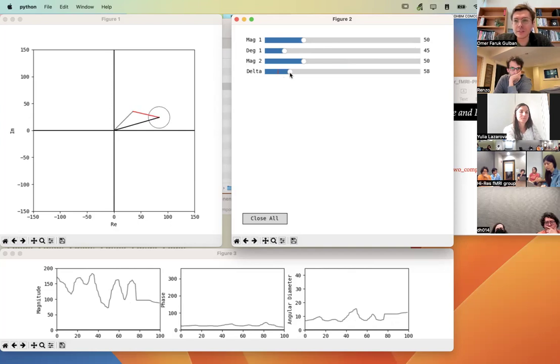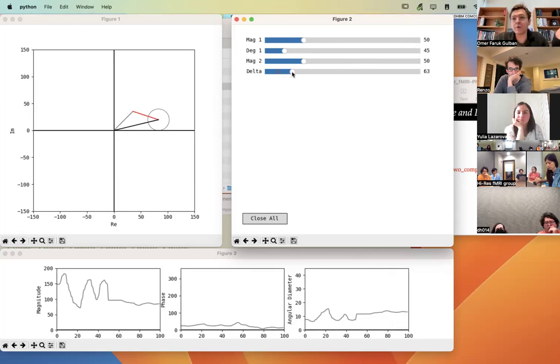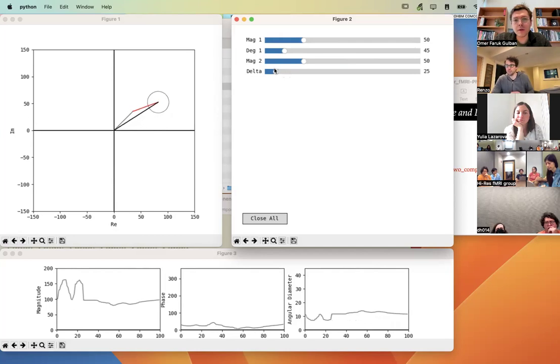So okay, just in an exaggerated way, I am almost making a comical situation here. Let's say that this is deoxygenated blood, okay? And basically the theory says, and this is Ogawa saying it in the '90s, that when the blood becomes more oxygenated, this intravascular component becomes more parallel to the gray matter component, right? So this is, let's say, activity, oxygenated blood. This is deoxygenated.